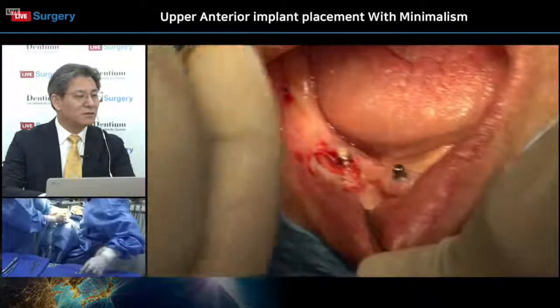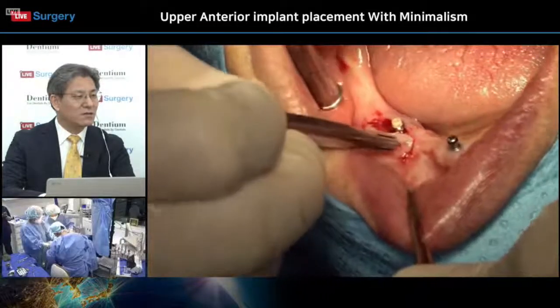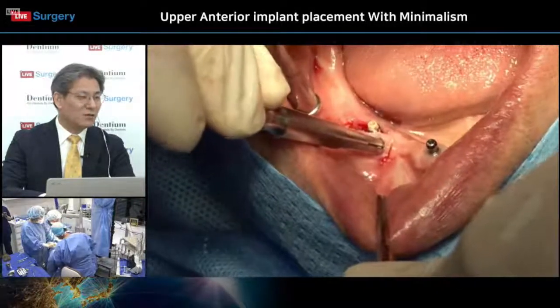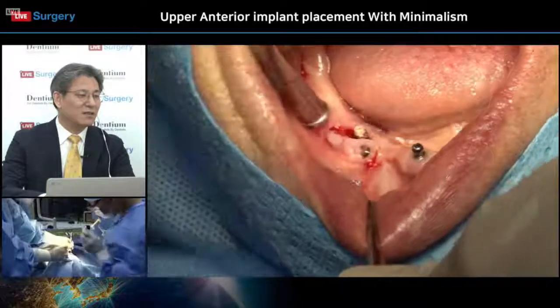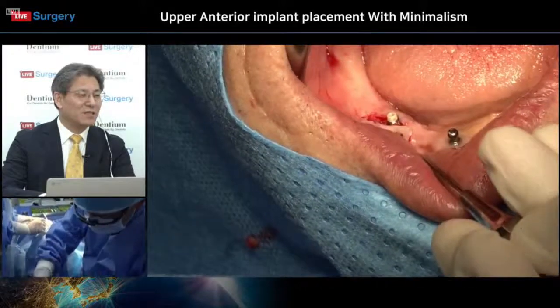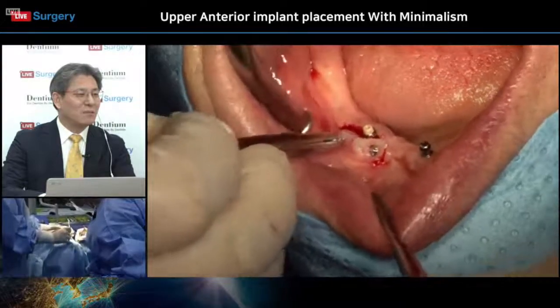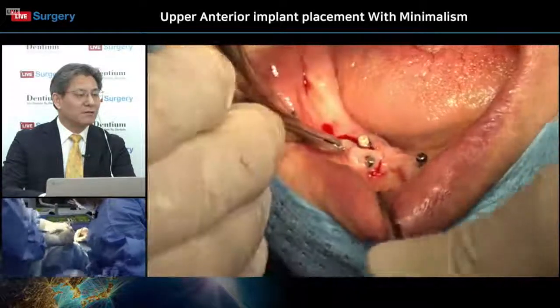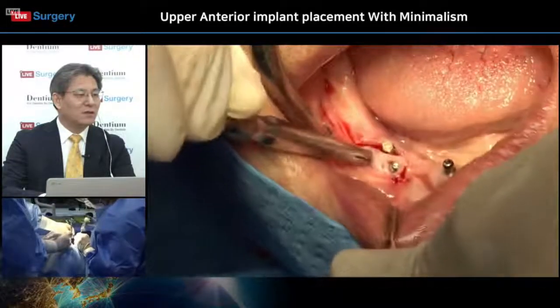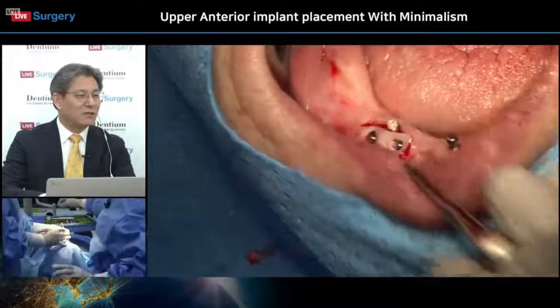Bone is very dense. So hard bone quality. So with the mallet, I think a little bit stronger malleting is needed. Oh, good. Wow. Yeah, just two shots and got enough fixation. Yeah, so. A little bit longer, but the pin is good quality. So very good, very easy. A slightly longer pin to fix the flap. Okay. Two shots and fixed.